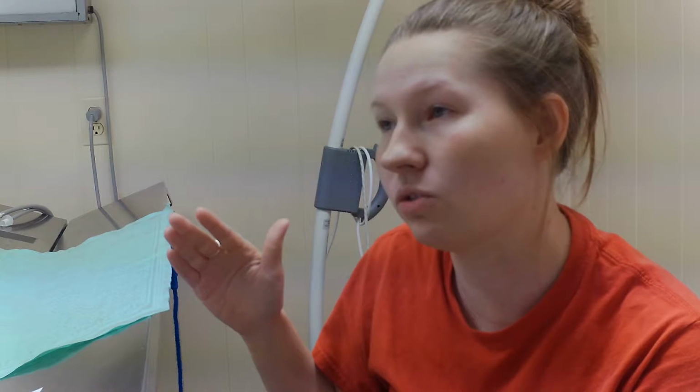So it's the way my doctor described it. It's not that it's unnecessary. It's just that you can do the same thing with an ordinary stethoscope, whereas with the esophageal stethoscope, it's a constant thing that you're constantly hearing. So if there's any kind of arrhythmia, or if you just hear the heartbeat skip a beat, it automatically tunes you in, like, oh, that's not right. Let me check on this patient real quick. So the circulating anesthetist or technician during surgery can walk around and do their thing and keep an ear out, sort of thing.